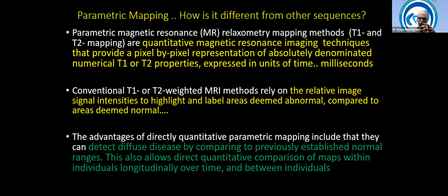During coming back to the equilibrium position, they emit some energy to the nearby surrounding matrix. So T1 mapping, we call this spin-lattice relaxation. That means the proton, during its spinning and coming back to equilibrium, releases some energy, and this energy is calculated based upon the acquisitions we take, and that is known as relaxometry or T1 relaxometry.